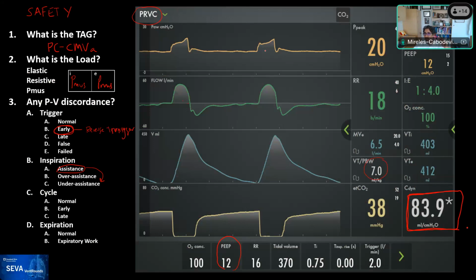So it's around 32 centimeters of water pressure difference that the patient is generating. So if you calculated the compliance then using 32 centimeters of water, this patient is generating a tremendous amount of pressure that is going through there.